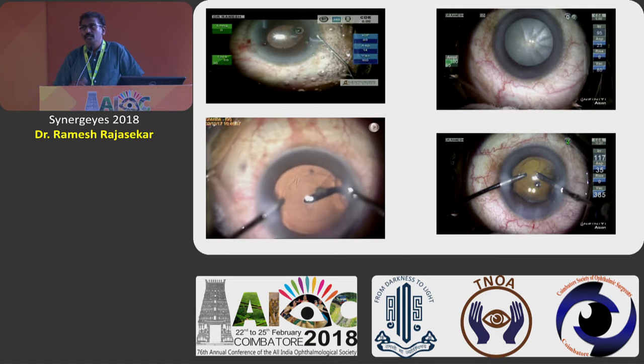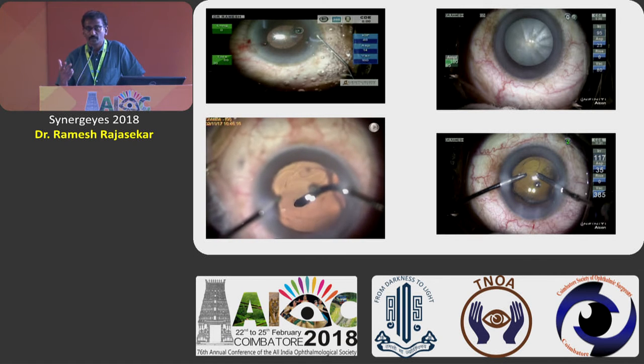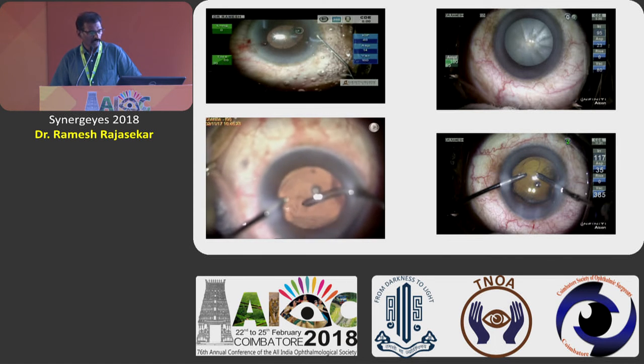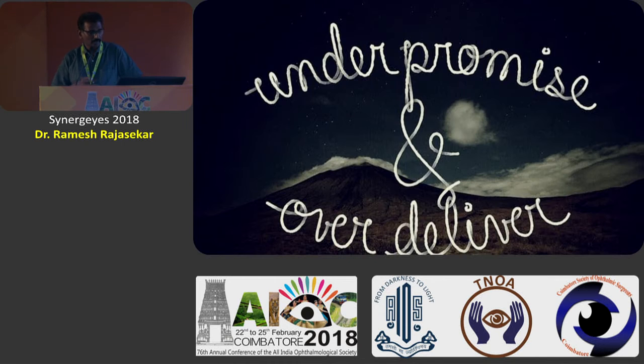And when it comes to surgical situations, we may land up with intraoperative issues like a capsular tear, again debatable whether we can implant it or not. And again, on the mature cataract slide, I remember one of my classmates who came with the other eye multifocal, and we may have to be prepared. The next technology, I think we are going to see how we can handle these sort of complicated scenarios. Intraoperative issues, always be more careful with your rhexis, focus on your rhexis, use new instruments.